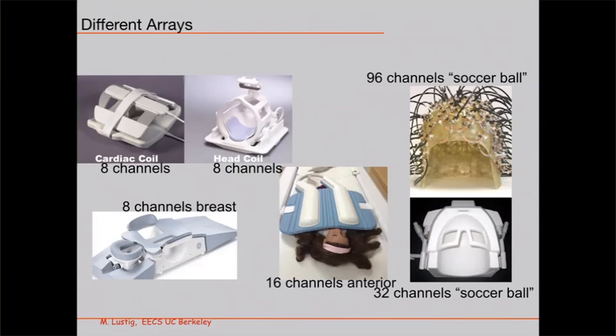All right, I wouldn't want... I mean, I do not envy the engineer that designed a 96-channel coil. I mean, it's painful.